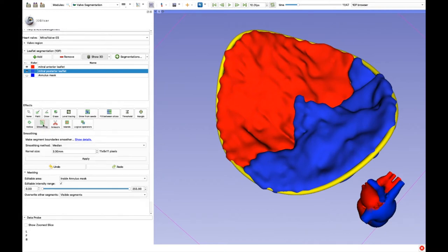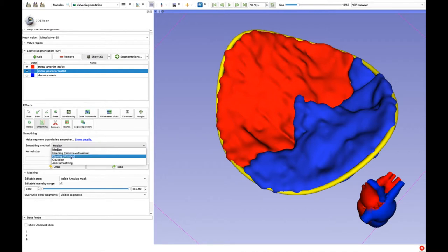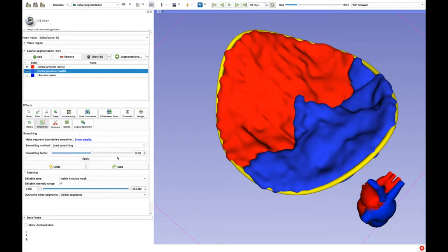We can now smooth the manual segmentation. There is more than one option, but we usually use joint smoothing with a coefficient of 0.35.